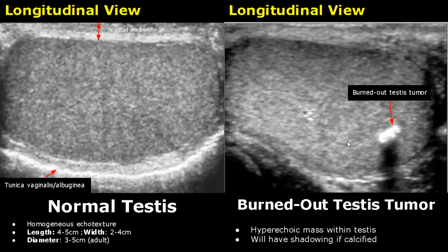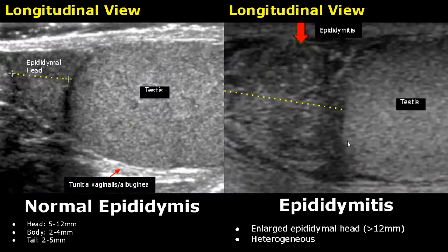The normal epididymis is slightly hyperechoic. The head measures 5 to 12 millimeters, the body measures 2 to 4 millimeters, and the tail measures 2 to 5 millimeters.